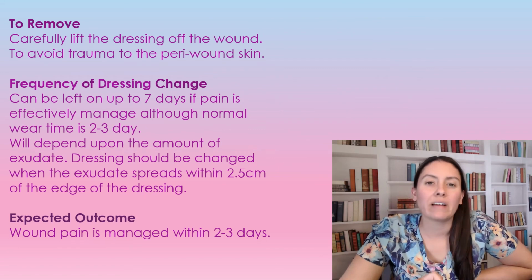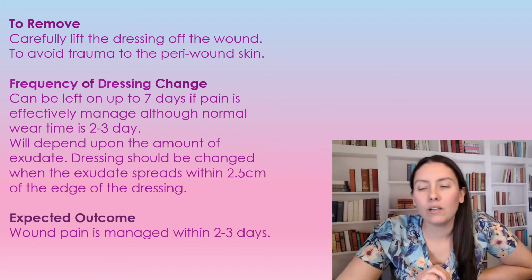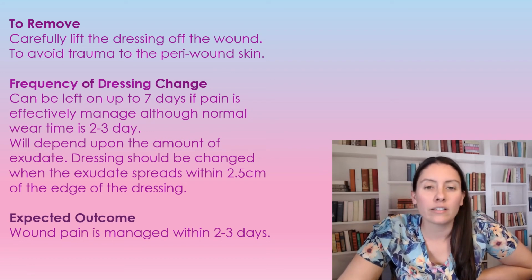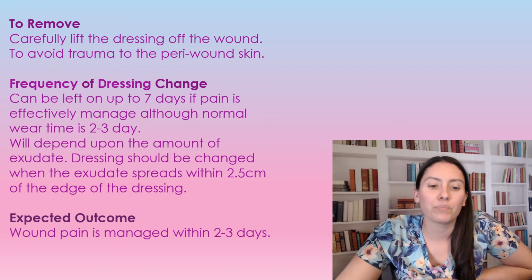So to remove the dressing, you're going to carefully lift up one of the edges and remove the dressing. Really super careful to avoid any trauma to the peri-wound or wound. This dressing can be left in place for 7 days, but normally it's about 2 to 3 days. So you want to make sure that the pain is being managed throughout that whole time. So as soon as the pain's no longer being managed, it does need to be changed, which is usually the 2 to 3 day time frame.